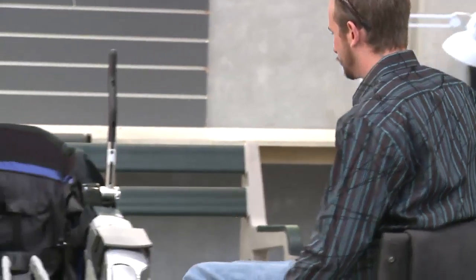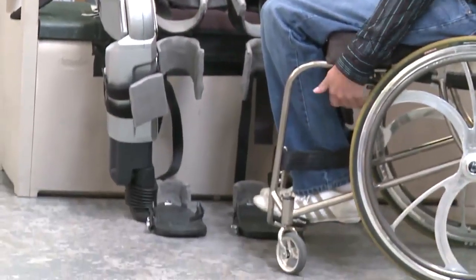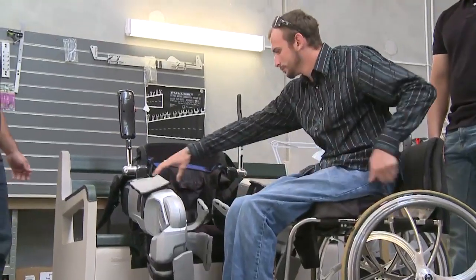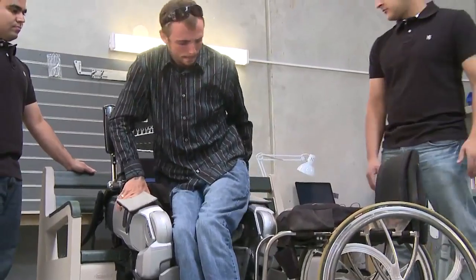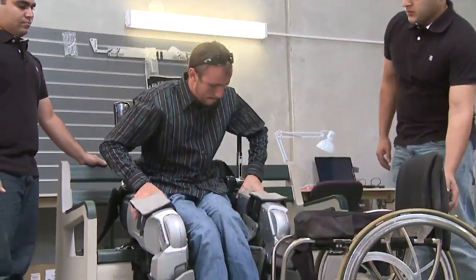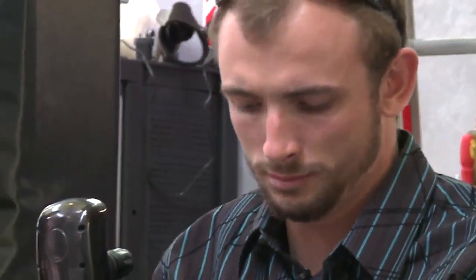When I go to jump on the Rex, I'll wheel my wheelchair so it's at a 90 degree angle with the machine. Then I just make sure that all the straps are clear, that I'm not going to go sitting on any buckles — it makes it a little bit difficult if you're sitting on a buckle to do it up. I self-transfer by holding onto the legs of Rex and just lift myself across to get my own legs sitting in the cuffs. From there, it's about five minutes all up to get yourself strapped up and ready to go.